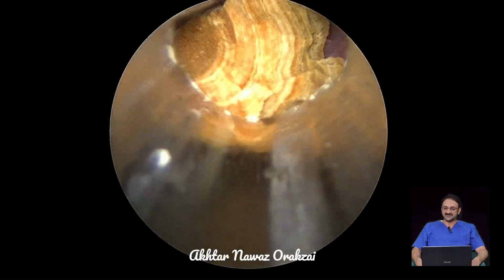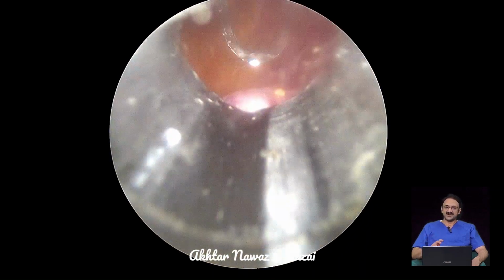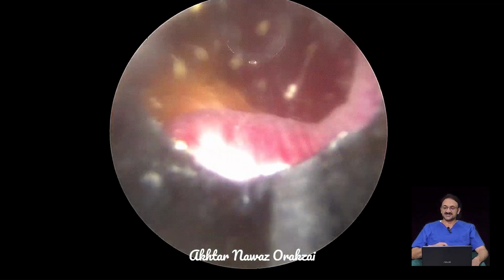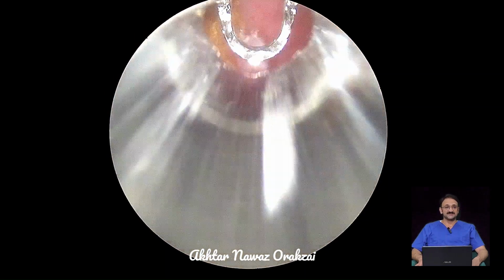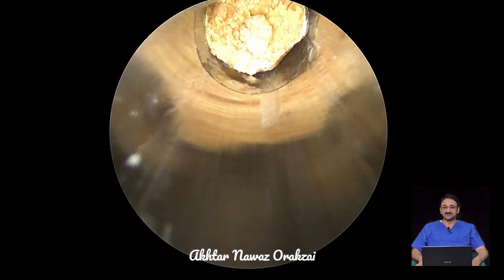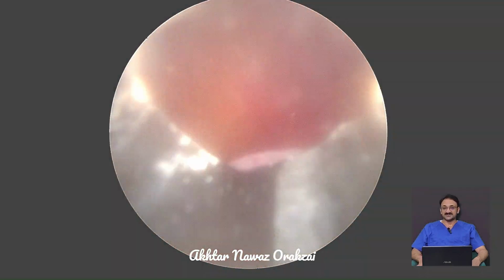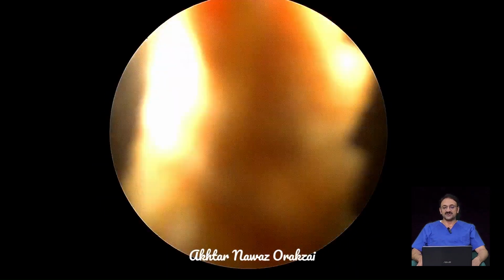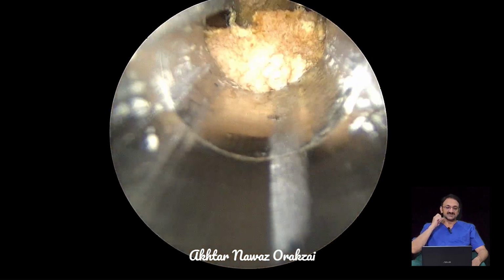the mucosa gets injured, or if there is a median lobe and by manipulation of the cystoscope or the stone punch the mucosa gets injured and it starts bleeding, there is a highly likely chance that the procedure may not be completed safely, and at times you can leave small fragments because of the clot or the bleed, because they are not visible. Here you can see that the vision is quite clear. We perform the fragmentation of the stone in a good manner, not to cause any bleed.